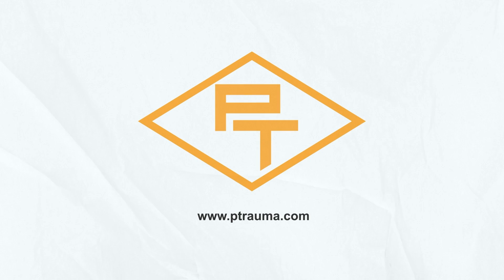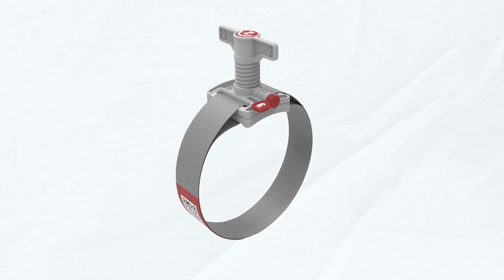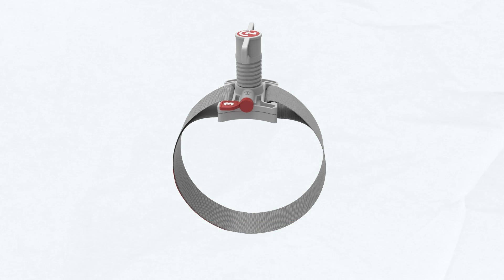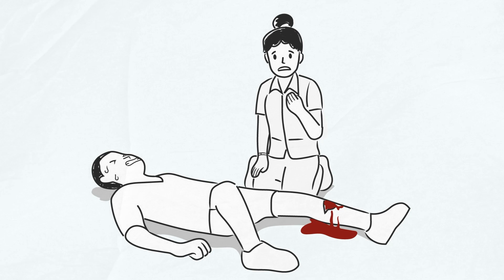Precision Trauma, the leader in critical bleeding control solutions, introduces Tourniquet — a new tool in the fight to save lives. Tourniquet is a new bleeding control device that makes life-saving bleeding control technology easy to use for civilians and first responders. If you or someone you are assisting has a serious bleeding injury, stay calm and follow the simple bleeding control procedure.